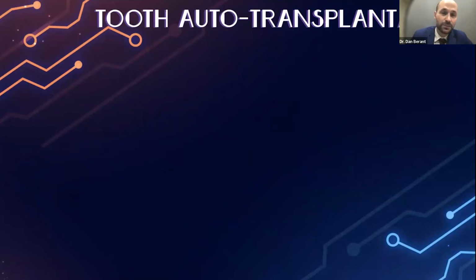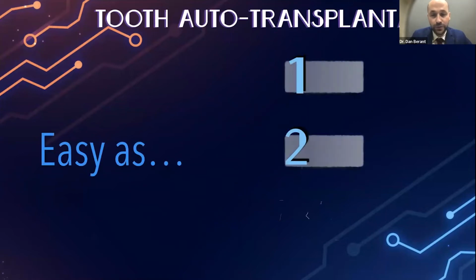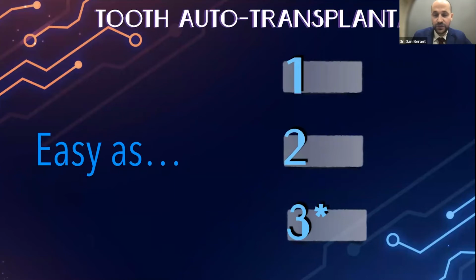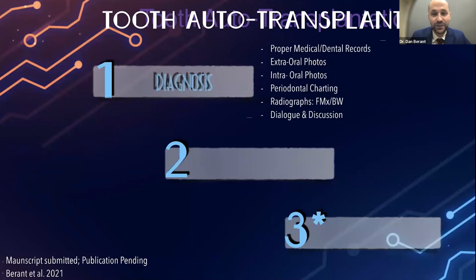And that last paper really emphasized the importance of a CBCT and utilizing a digital workflow. We were able to create a protocol of our own, and we broke it down into 3 steps. The first step is diagnosis. We emphasized this in the beginning of this presentation, but I'll emphasize it again. It's very important to take proper medical and dental records, extraoral and intraoral photos, and radiographs, and have that dialogue and discussion with the patient about the possible treatment options.